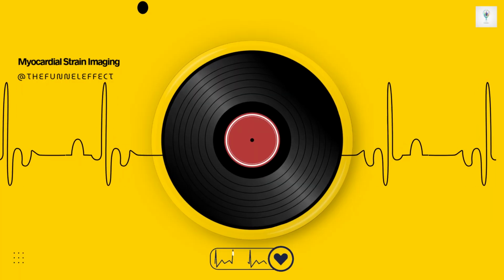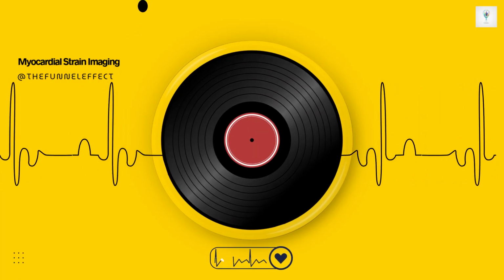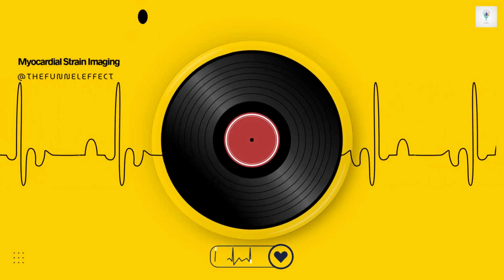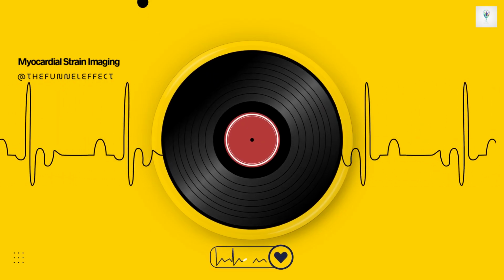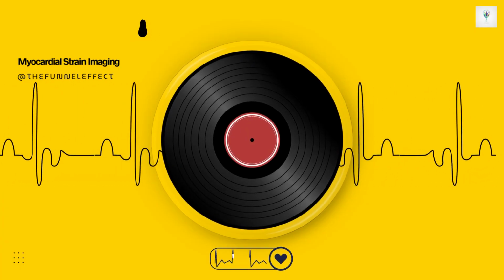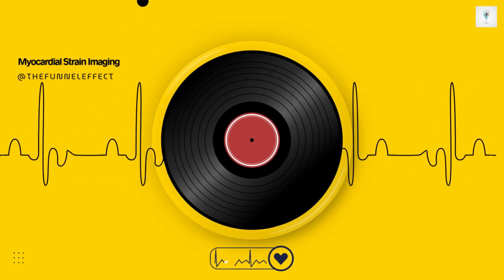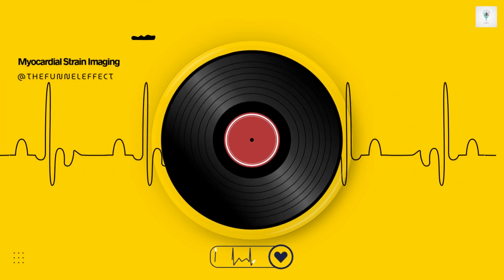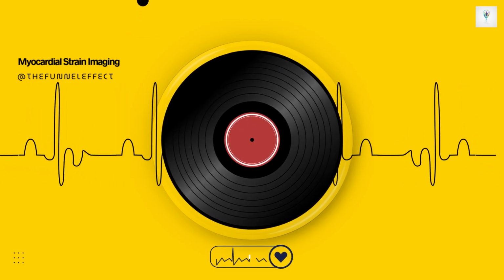Are there newer CMR techniques trying to bridge this gap, get the accuracy without the fading tags? Yes, absolutely. The field is moving fast. One promising technique is displacement encoding with stimulated echoes, or DENSE. It uses pixel-by-pixel displacement vectors, which gives it higher spatial resolution than tagging. Another one is strain-encoded imaging, often called SENC. This offers potentially superior spatial and temporal resolution. Some research suggests it might even allow for near real-time strain imaging with CMR in the future. These advanced methods are really pushing CMR back towards being the comprehensive strain reference standard.